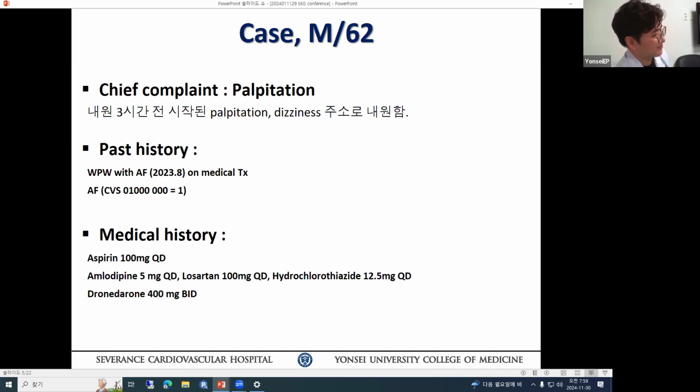No. Our question is, your patient had an accessory pathway and a left-right pulmonary vein focus for a long time. Okay, what is the strategy? You ablate the accessory pathway. No, we ablate the PV first, then ablate the... One single vein isolation? Actually, we did a focal ablation. It's a PV tachycardia, not AFib. Okay, so with this high resolution mapping, you can actually find the focal trigger inside the PV.